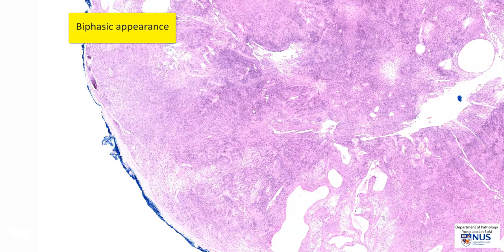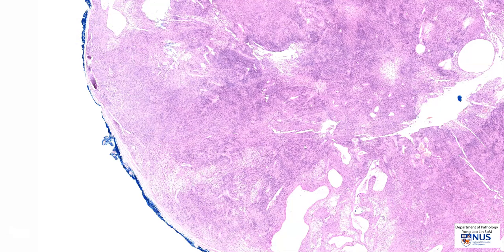Biphasic because there are areas that are more compact and cellular, and there are other areas that are much less cellular and have a more pale appearance on low magnification. Let's have a look at another section from the same tumor, which shows another feature of schwannoma.